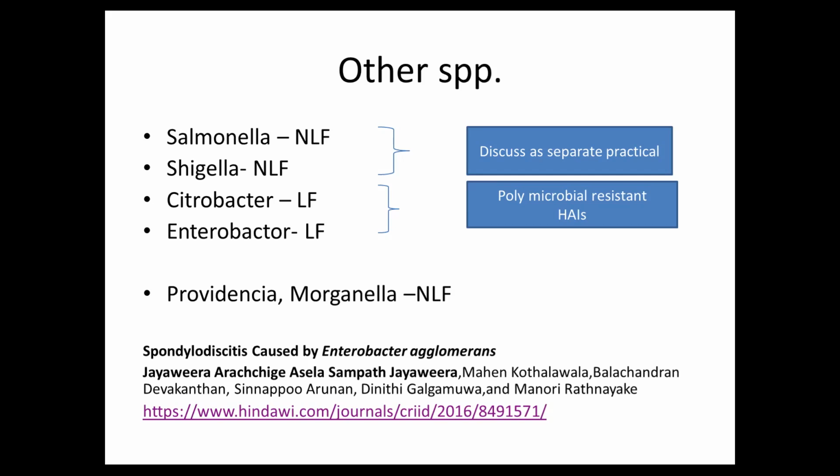So the CT and MRI of the thoracic area show the area that is disrupted. Following Enterobacter agglomerans infection, you can see the CT thorax, how it has decayed. It's almost gone. You can see further the regeneration, now it's completely recovered. So for the discussion, just read this article. Thank you.